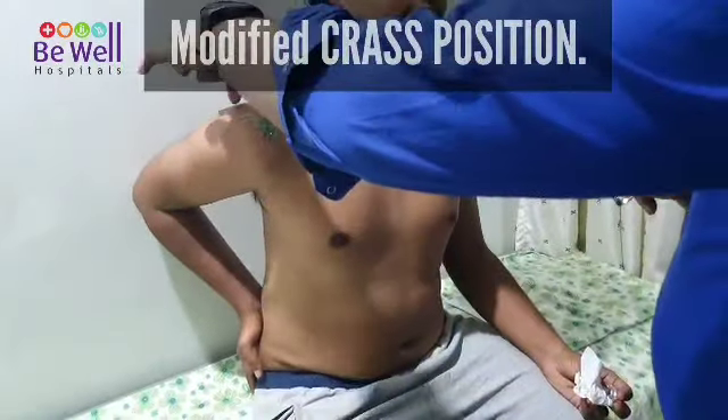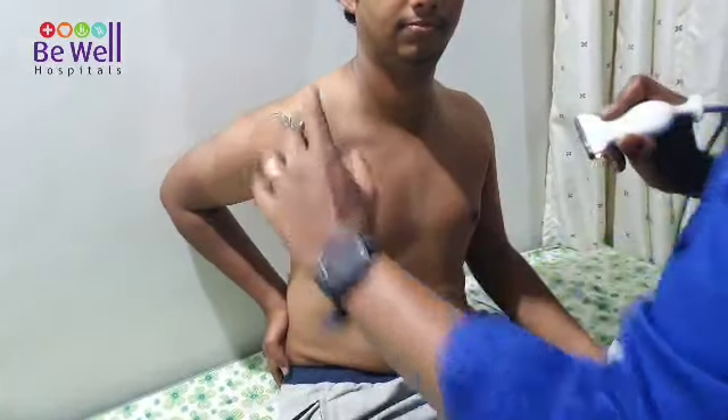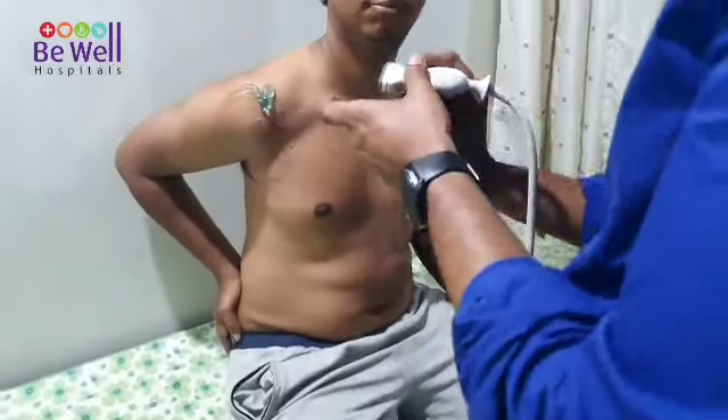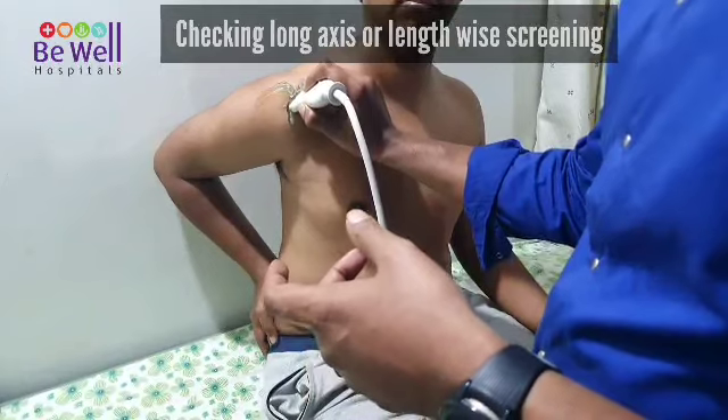Now the acromion is here, but you have tilted your scapula in such a way that the supraspinatus is in front. Now, as I place my probe on the long axis of the supraspinatus.